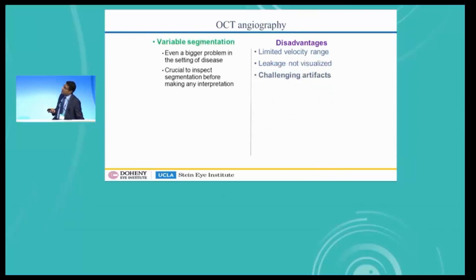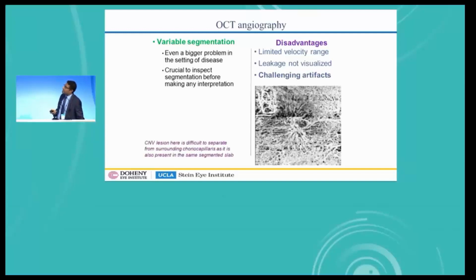Another big challenge, of course, is artifacts. You can have problems with, you have to get the boundaries segmented correctly. Michael talked about, you have to pick your layers, and sometimes it can be a challenge.